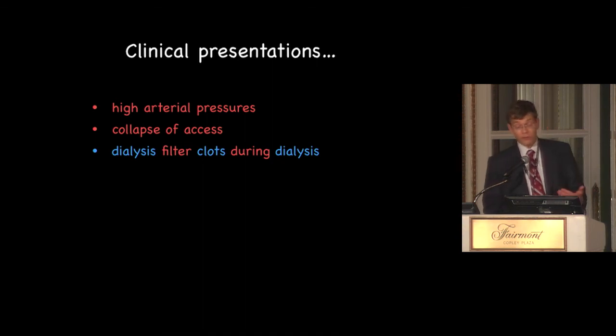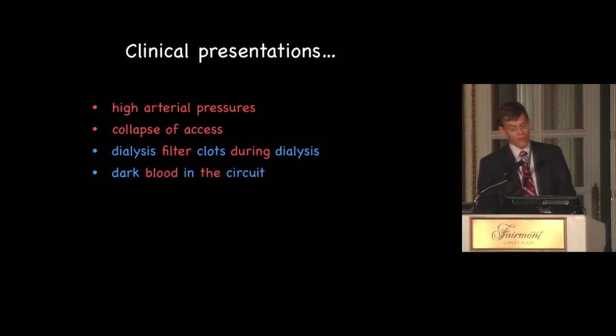Dialysis filter clotting during dialysis can be with an outflow or inflow stenosis. It's basically a sign that you have recirculation, and you can get that with either low flow in the access, where you don't get collapse, or with an outflow stenosis. The dark blood in the circuit is similarly associated with an inflow or outflow stenosis. High venous pressure is pretty clear: you get a venous outflow stenosis.